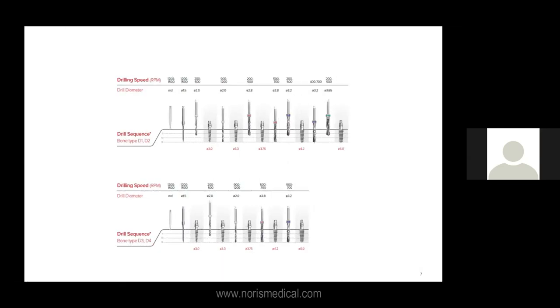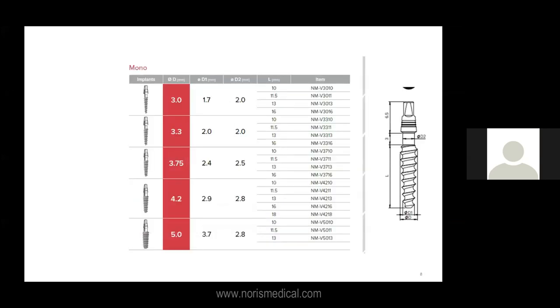So here you can see the chart, the recommended chart. As I told you before, it of course appears in the catalog, but in most cases, the pilot drill will be sufficient for 3.75. Try to use the minimal set possible, the minimal set of drills possible in order to insert this implant. Of course, while not creating a large stress on the bone.